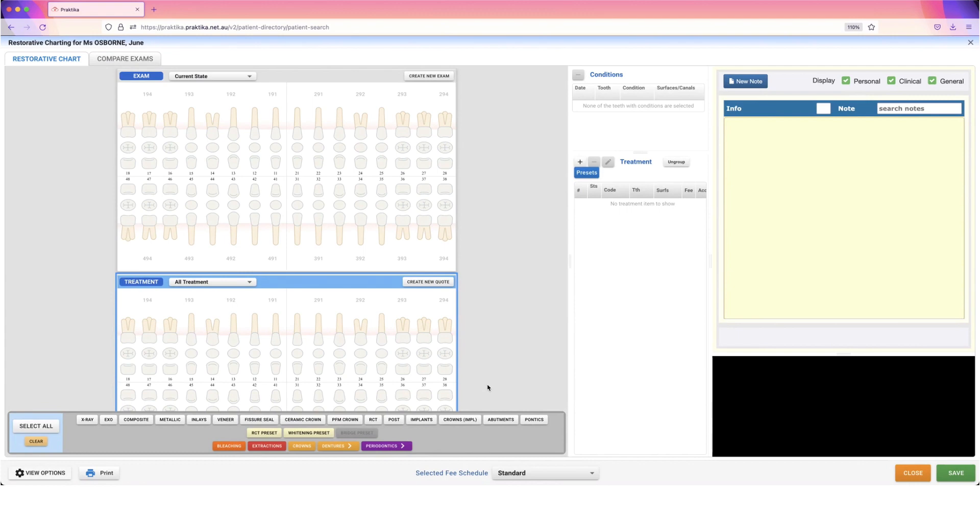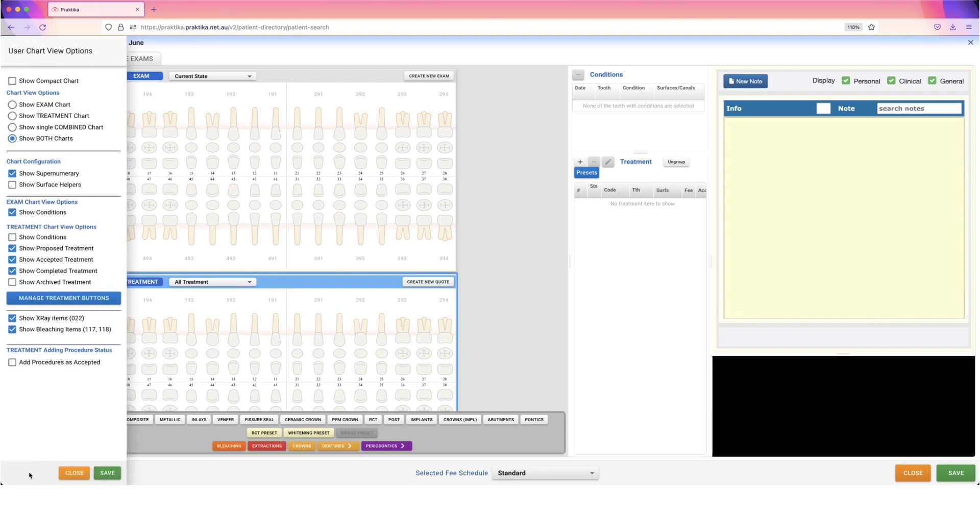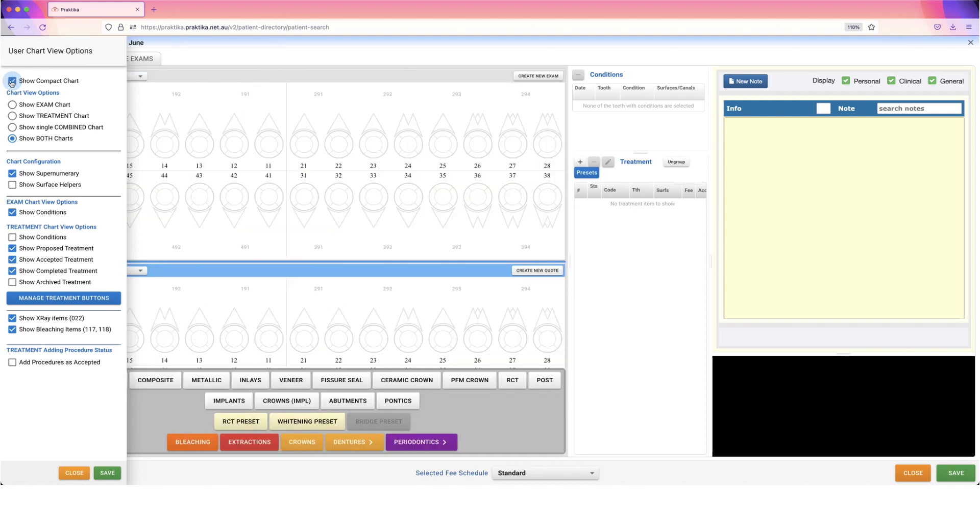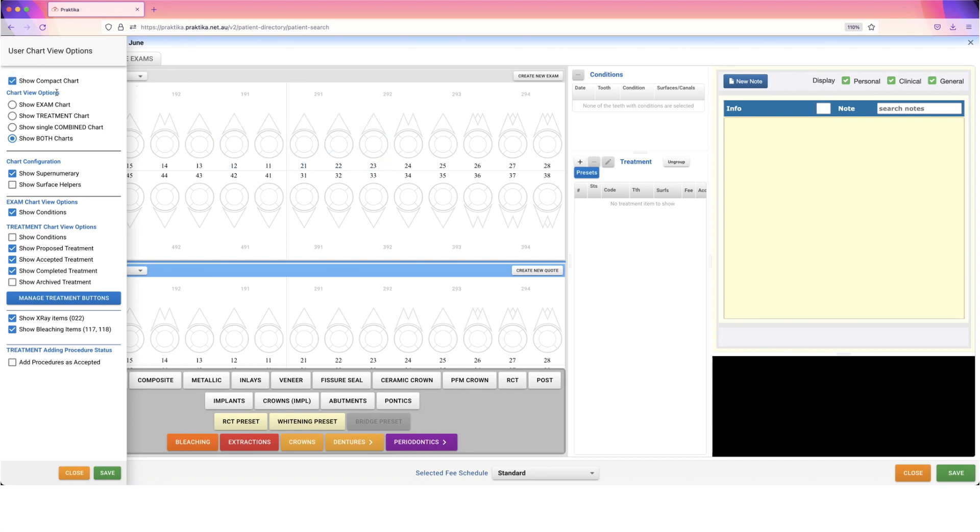There are also some other things you can change. Go to the left-hand side at the bottom and click on View Options. The first is Compact Chart, which changes what this actual charting looks like. Rather than more of a tooth shape, it's the generic round charting shape. Personal preference: I like this one because it gives me a larger surface area to select, but you can do whatever works best. There are quite a few other options.